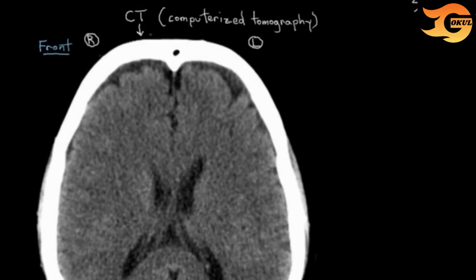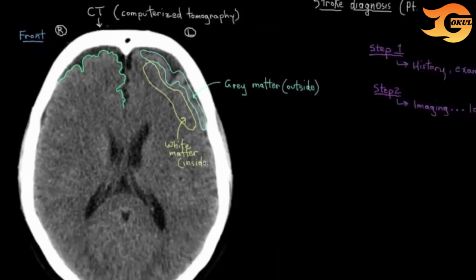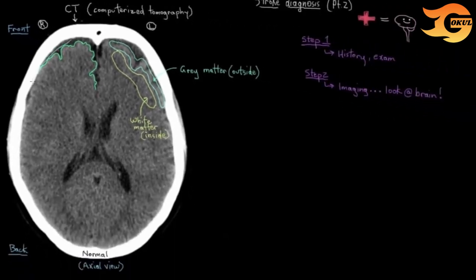What are some features of a normal brain on CT? You can see the nice, fairly well-delineated curves of the brain tissue, and the edges — the surface of the brain — look a little different from just below the surface. That's a reflection of the gray matter on the outside and the white matter on the inner parts. The normal brain also looks nice and symmetrical — everything's pretty even about the left and right sides.